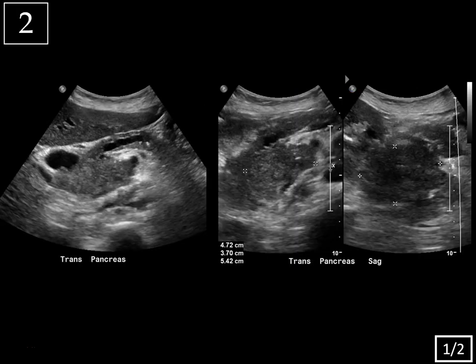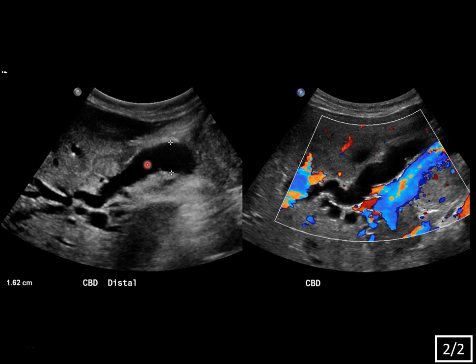On this left-hand image, you can see that the pancreatic duct is dilated — it measures over four millimeters — and that's leading to this lobulated pancreatic head mass that's heterogeneously hypoechoic, solid in appearance. This transverse image shows the calipers around the mass, and the sagittal image shows how large it is, measuring up to 5.4 centimeters, also heterogeneously hypoechoic. You can see the pancreatic duct leading right to it. This image shows marked dilatation of the common bile duct leading up to the mass, with the duct dilated to 1.6 centimeters.